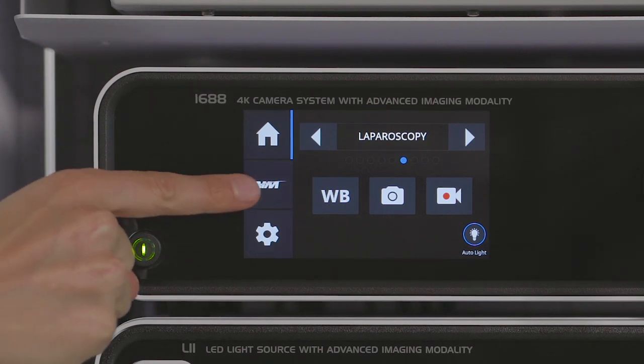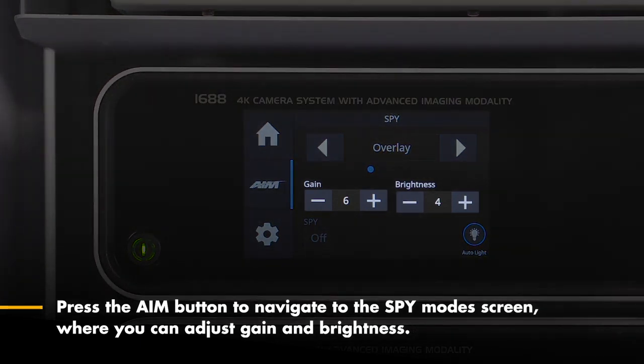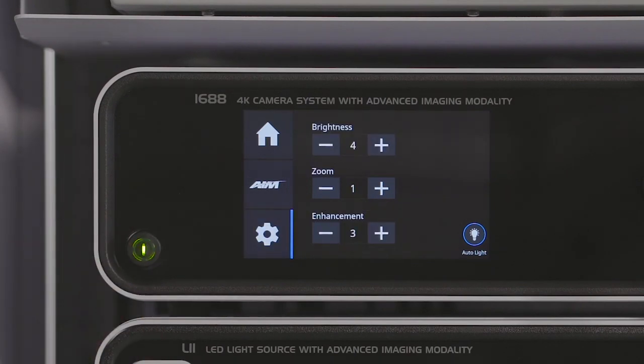Press the AIM icon to navigate to the SPY menu. Here you can activate SPY fluorescence, scroll through SPY modes, and adjust gain or brightness.